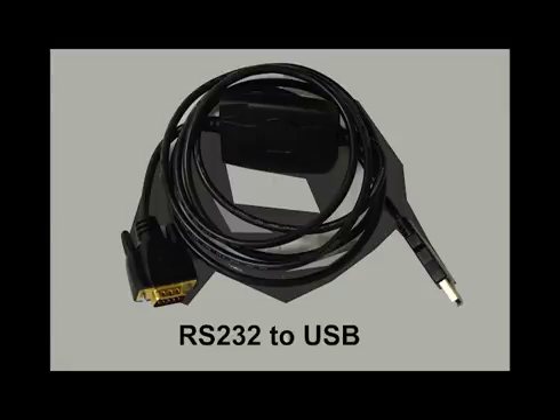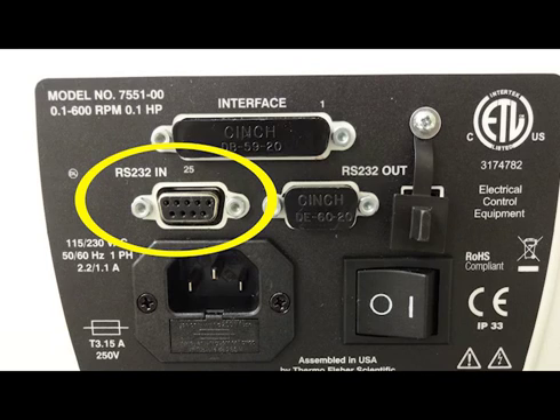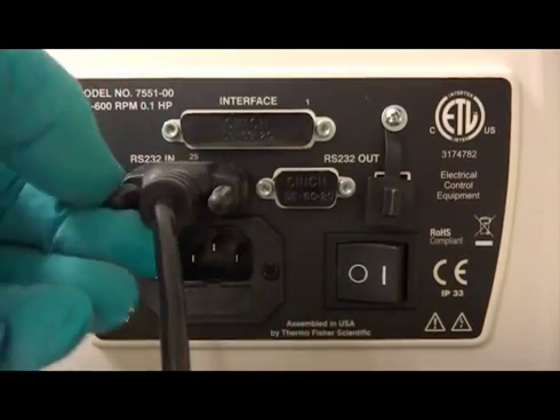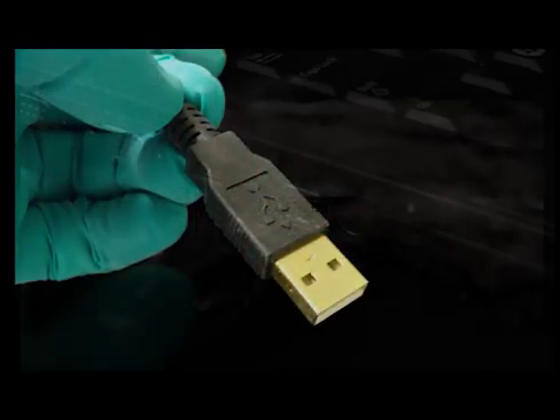Using the provided RS232 serial to USB connector cable, connect the male end of the RS232 serial cable to the RS232 IN port on the back of the MasterFlex pump. Connect the USB end to your computer.